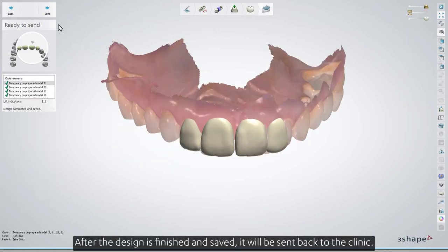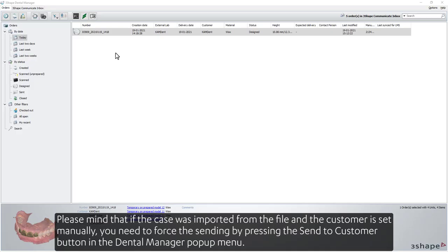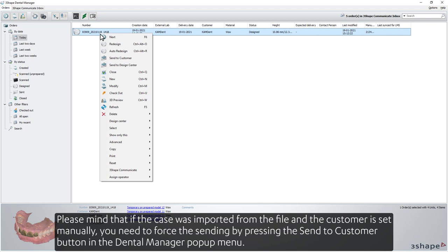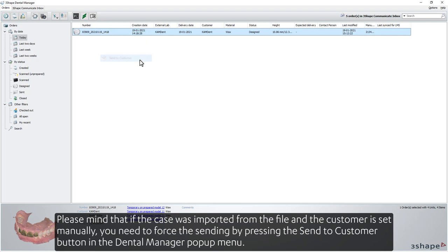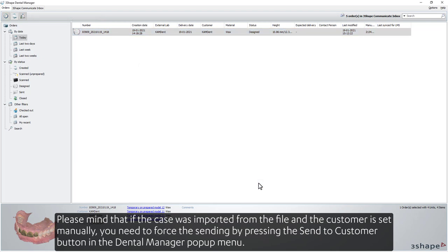After the design is finished and saved, it will be sent back to the clinic. Please mind that if the case was imported from the file and the customer is set manually, you need to force the sending by pressing the Send to Customer button in the Dental Manager pop-up window.